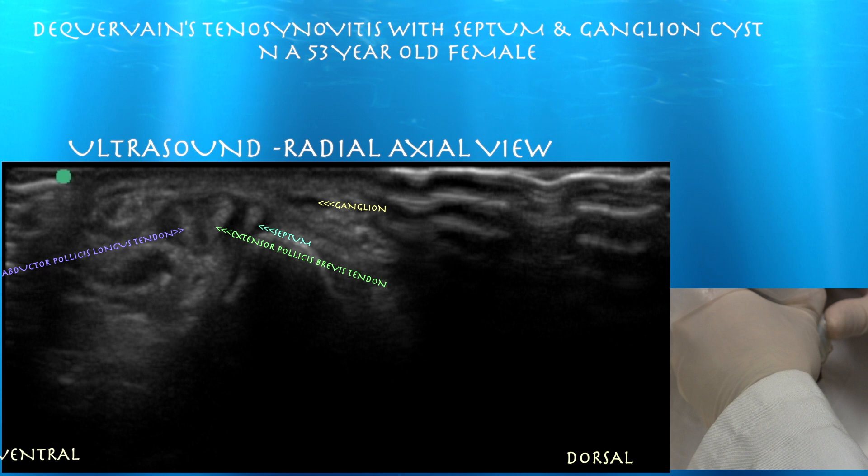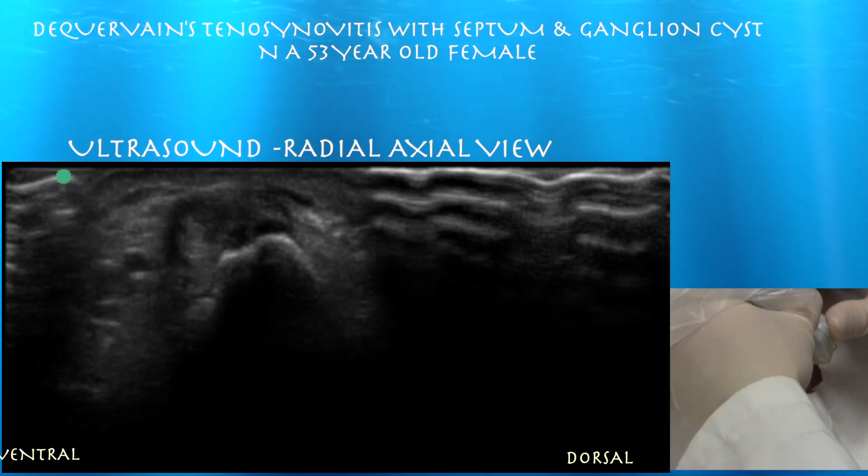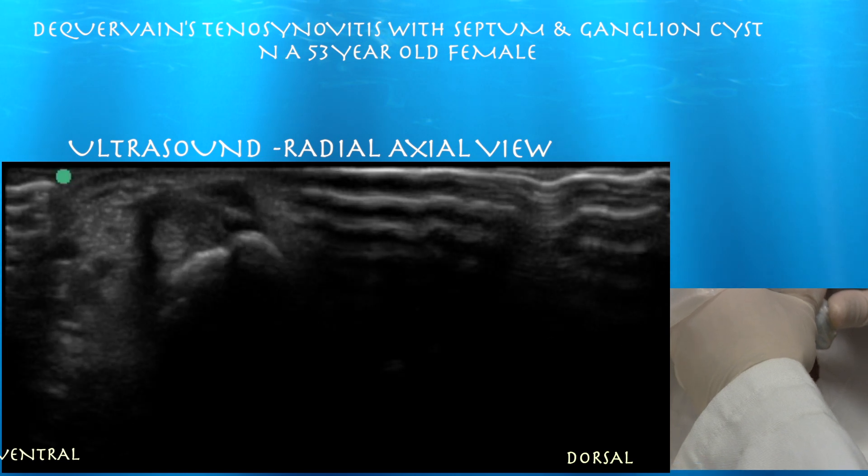Here's a fairly good view of those two tendons right next to each other. You can make out the septum, which is somewhat thick — you may mistake it for a tendon — but it's just part of the septum, which you can sometimes find within this first extensor compartment. You can also sometimes find different slips of the tendons themselves within this first extensor compartment.